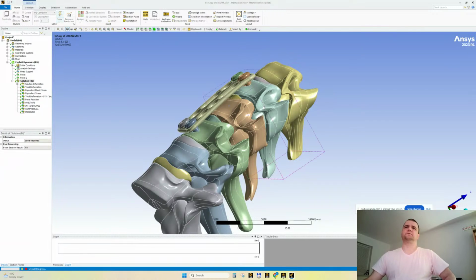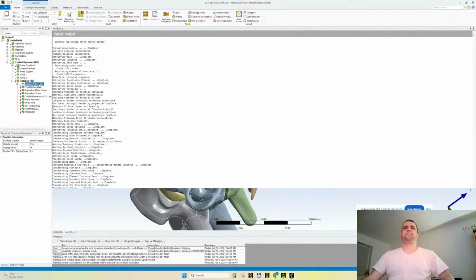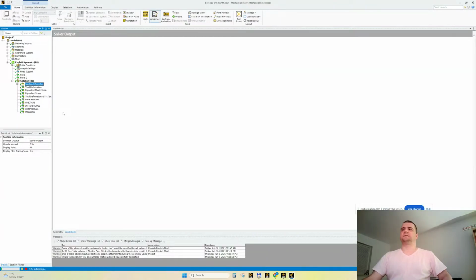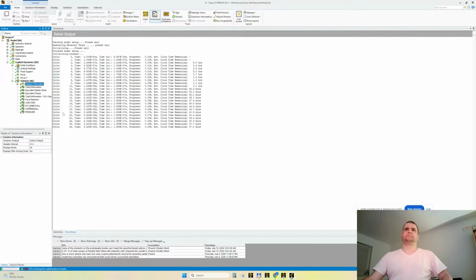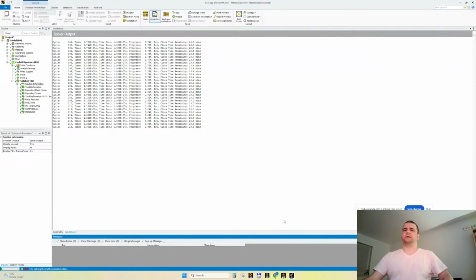The load of 7 kilograms and 4 kilograms, 76 newtons and 40 newtons, come from the weight of the head, let's say. This is why normally we should not increase these loads. Yes, it started. Let's see if we still have 25 minutes. Oh, even better, a little better.